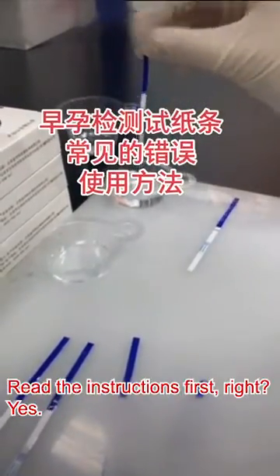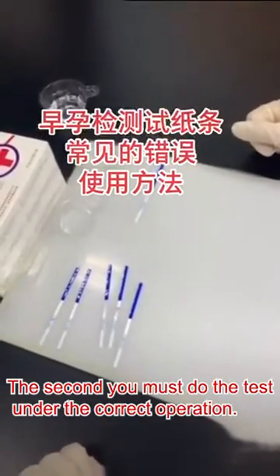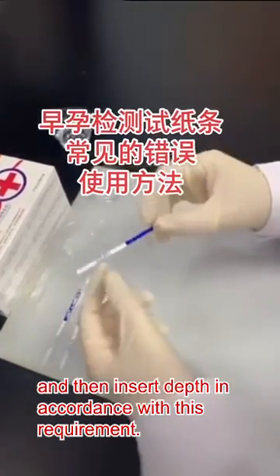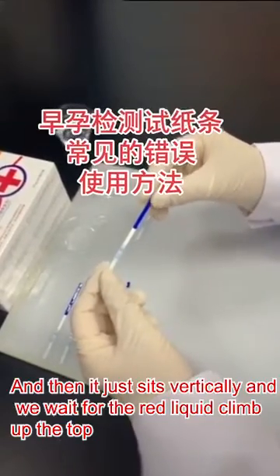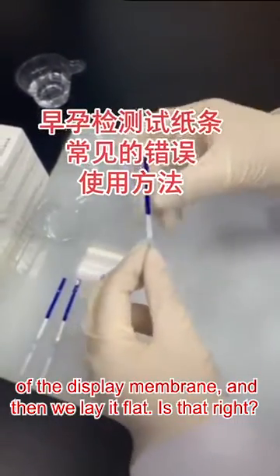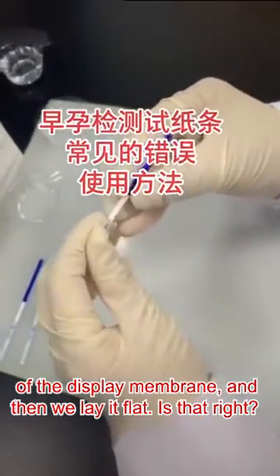The membrane is white. Read the instructions first, right? Yes. Second, you must do the test under the correct operation. Dip the urine into the right position, and then insert to the depth in accordance with the requirement. And then it just sits vertically and we wait for the red liquid to climb up to the top of the display membrane. And then we lay it flat. Is that right? Yes, that's right.